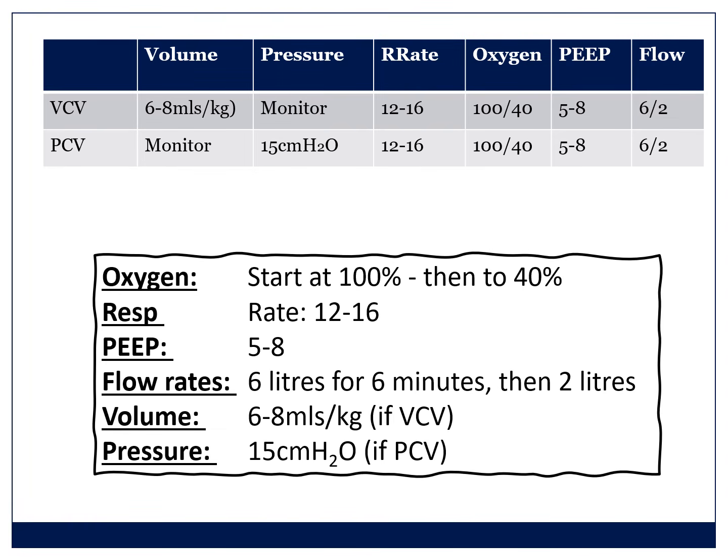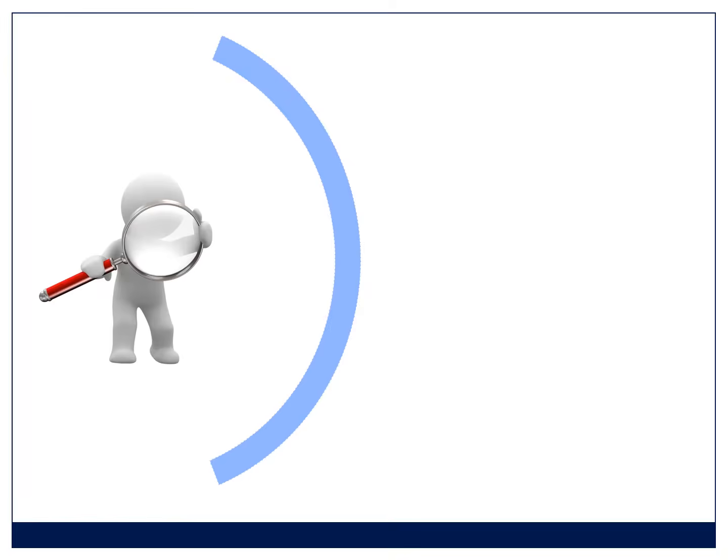So in all of these patients, you give them the oxygen that they need, you set the respiratory rate, you set the PEEP, you do the flow rates the same, and then all you're really changing is whether you set the volume or you set the pressure.